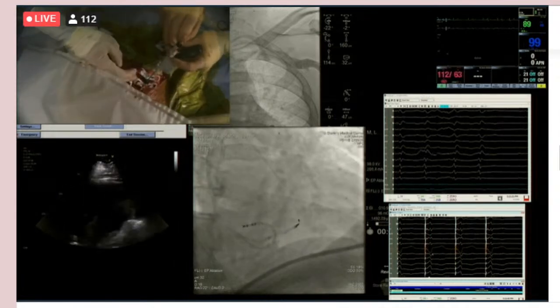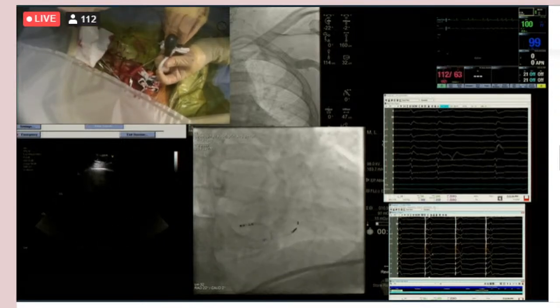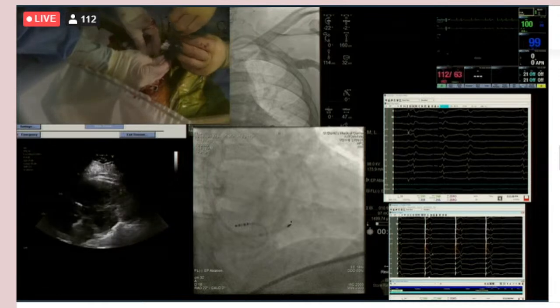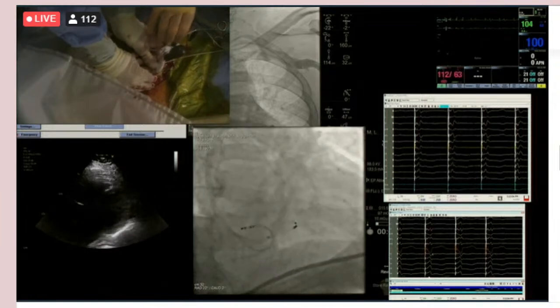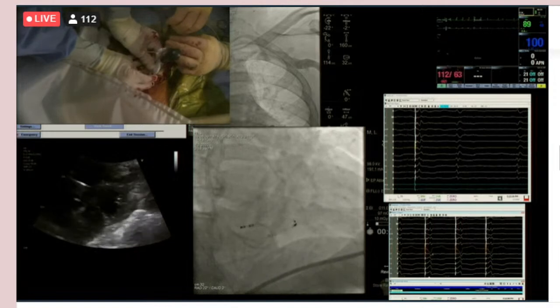Rodney, you said you liked ultrasound, but would you ever use ICE for this? Well, yes, hold that counterclockwise. Yeah, you could, and we talked a little bit about doing it today, and I'm not sure I necessarily want to overcomplicate the thing. What was the impedance? 490s there.